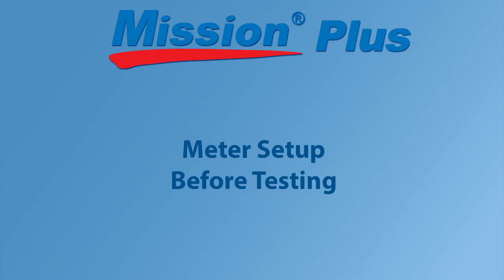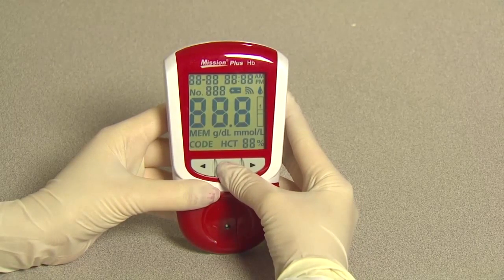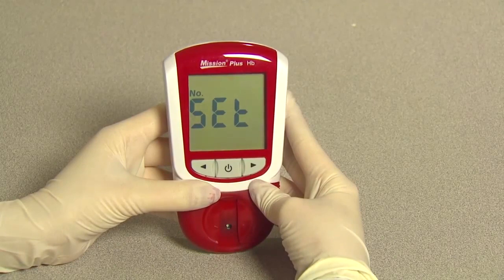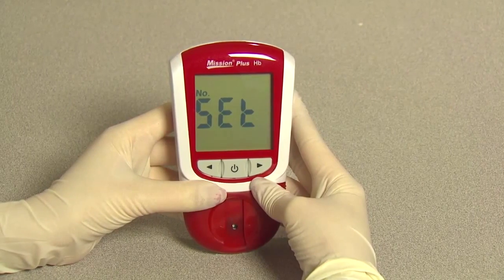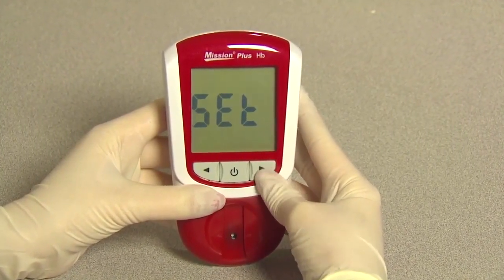Meter setup before testing. To begin initial setup, press and hold the power button for 4 seconds after inserting the code chip to enter the meter setup mode. The test number setup screen will appear first. You can navigate between the different setup sub-modes by pressing right or left.